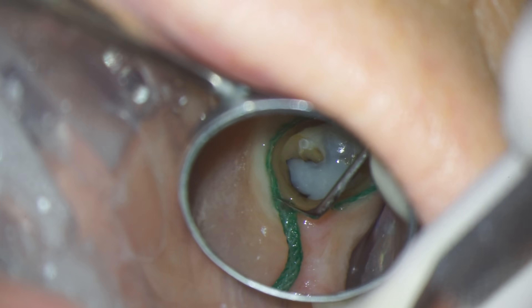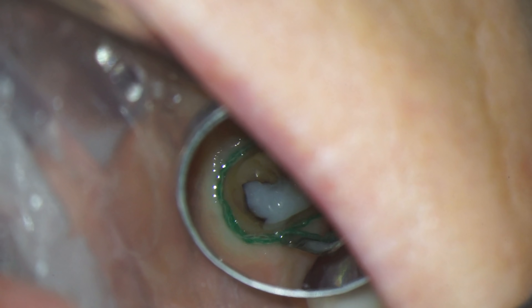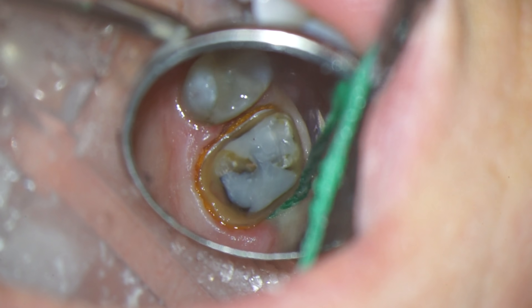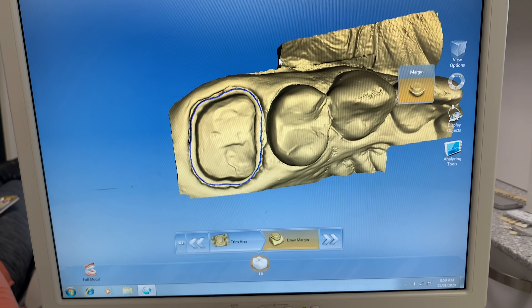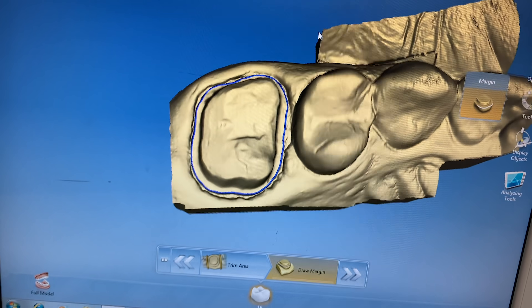Then we need to get the gums out of the way to make sure that our digital scan of this tooth is perfect and we have enough room for the porcelain. We take that out, spray the tooth with the powder, and then take our digital images. Here is a 3D model that shows exactly that little mountain road I was telling you about.